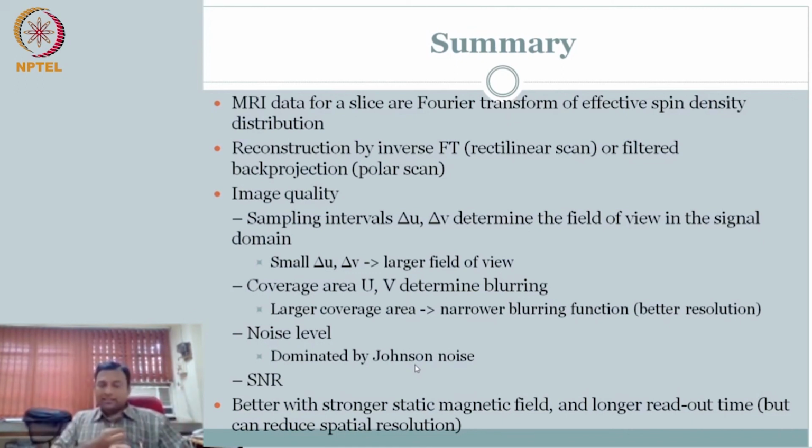Here in MRI, you have several different properties coming in. It was mu in X-ray based CT. Then we talked about only essentially acoustic scattering or impedance mismatch in ultrasound. Whereas here, look at the different fundamental properties of the tissue: spin density, the relaxation time in transverse, the relaxation time in longitudinal. This is what we covered. There are other parameters as well. I think this summarizes what I wanted to cover. Please play the video several times, get yourself comfortable.